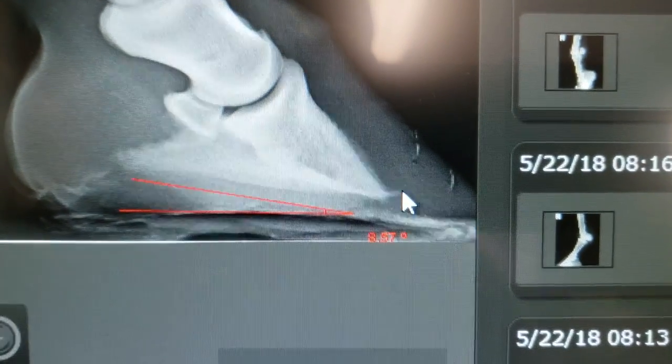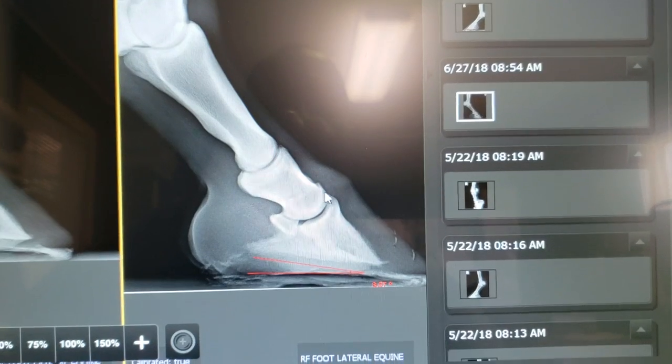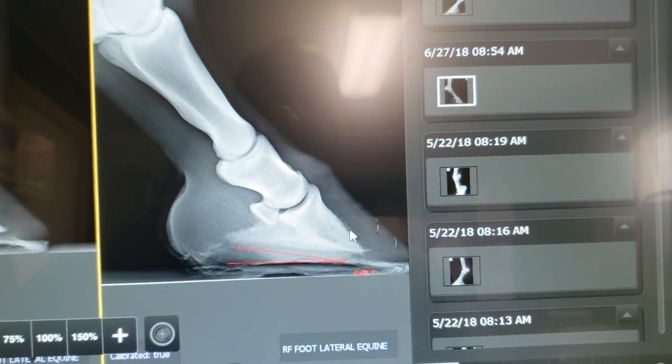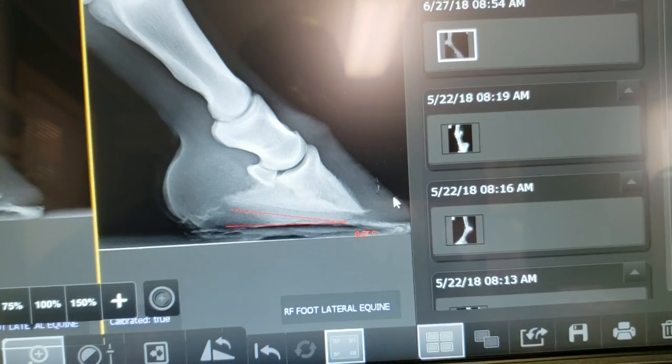These are all signs of pedal osteitis in the horse. Stepping back and looking at the big picture, the bones seem to be in fairly good alignment, but you can see there is separation down here — a little bit of rotation or laminar separation.